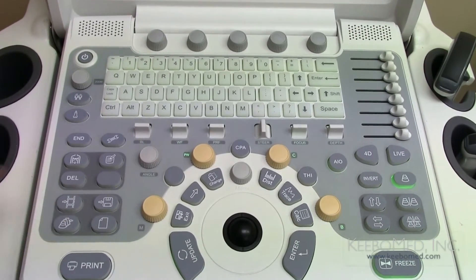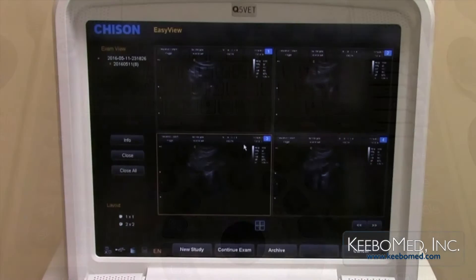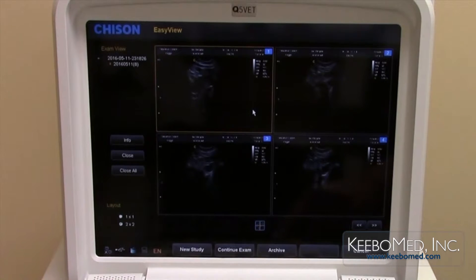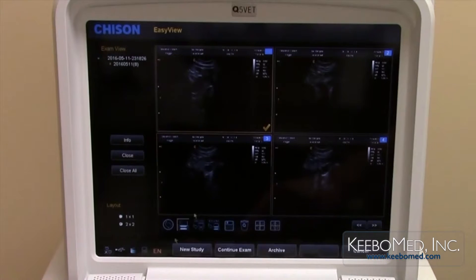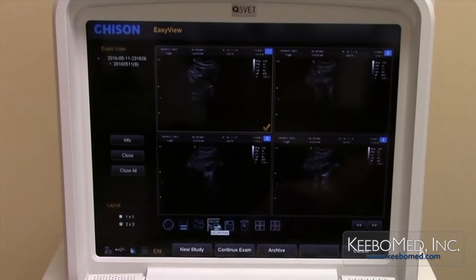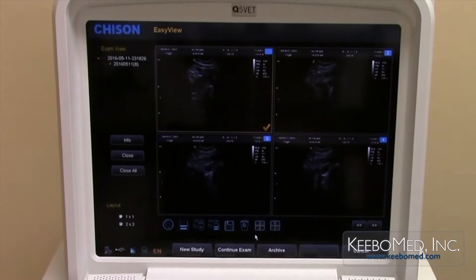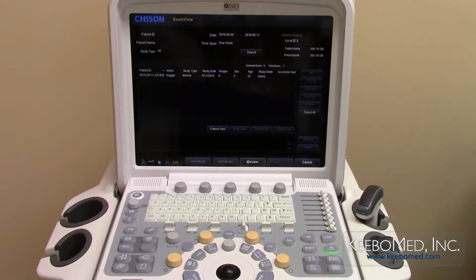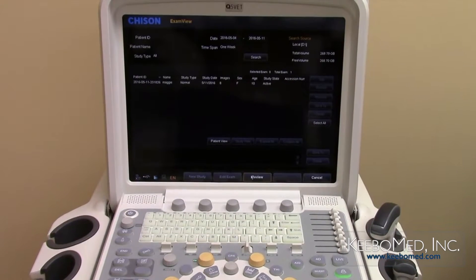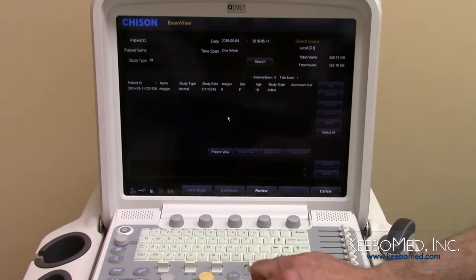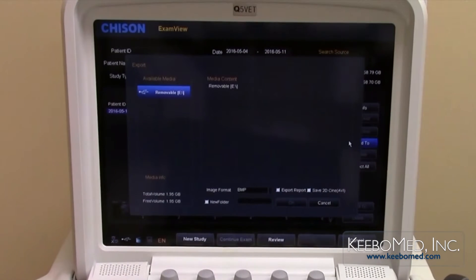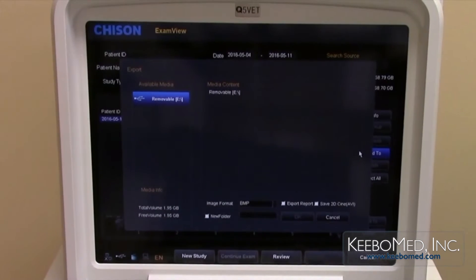Press the exam view button to show all the different exams that have been saved. Select the desired exam to quickly print, send through DICOM, save, or delete. Using the trackball, select the archive option and press enter to confirm — this shows a quick view of all patient files saved. To save a file to USB, choose the desired file, select the send to option, and choose from several image formats to export to USB.